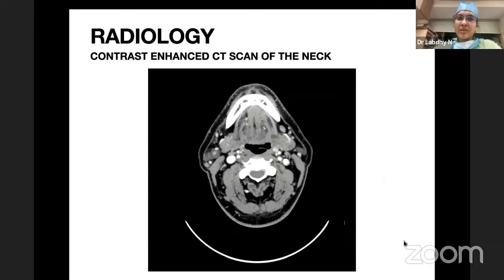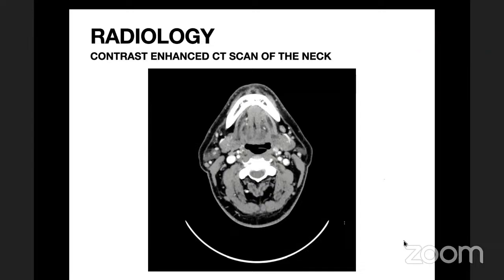The patient may not be motivated. There can be leaks in the TEP, central or peripheral leak. The central or peripheral leak will not cause non-voicing. What are the causes for non-voicing? A patient who has been voicing for a year comes back and says that I'm not able to speak since 2 weeks. What will you suspect?